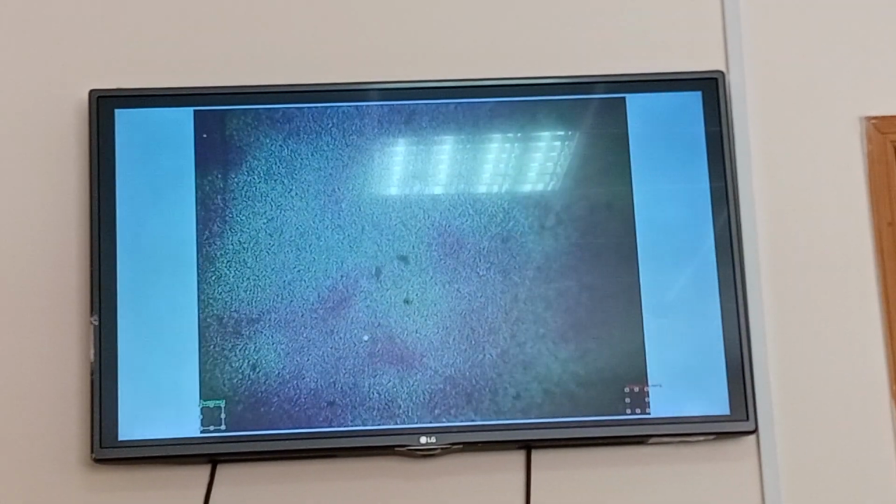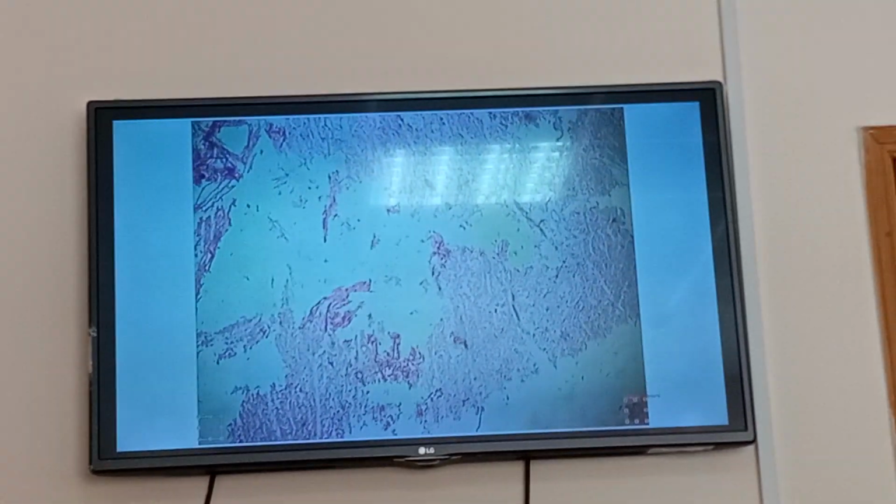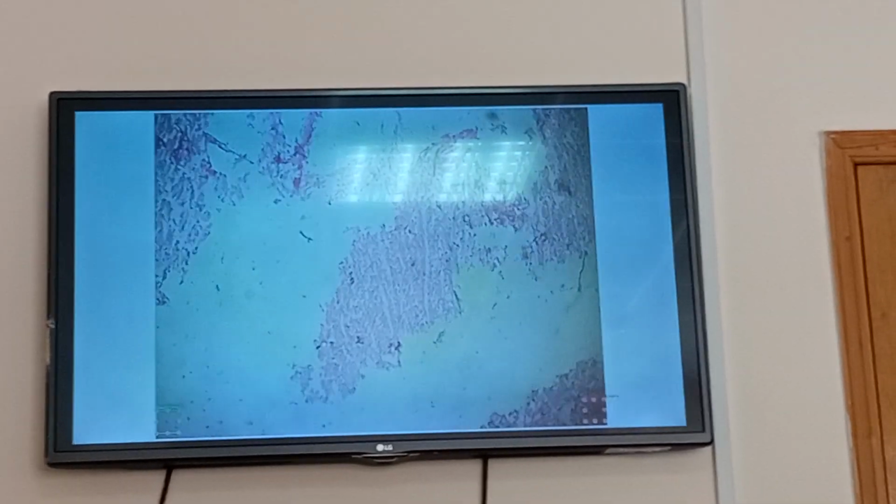Slide name. Caseous pneumonia, a severe form of caseous pneumonia, severe form of tuberculosis.